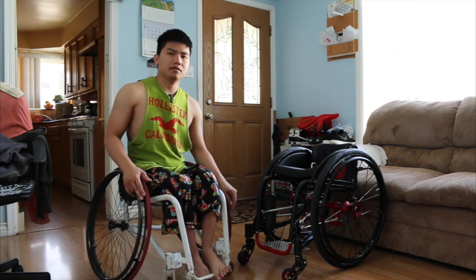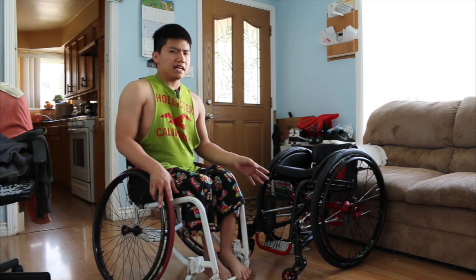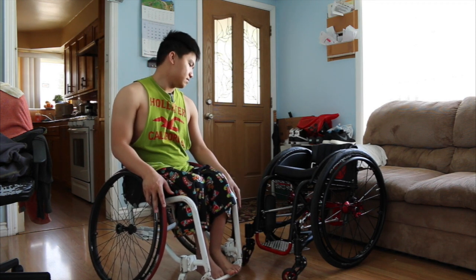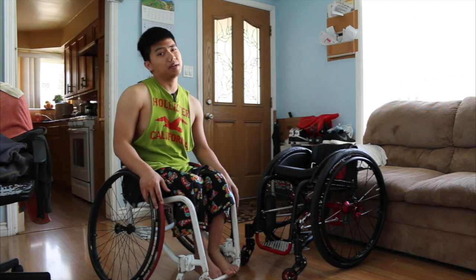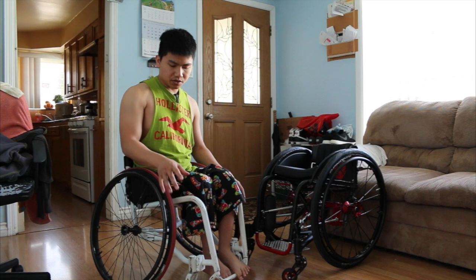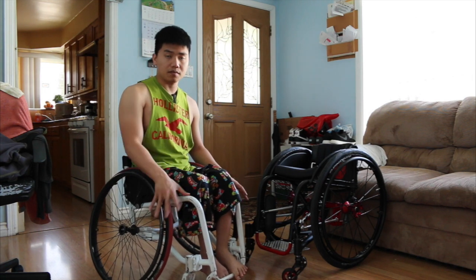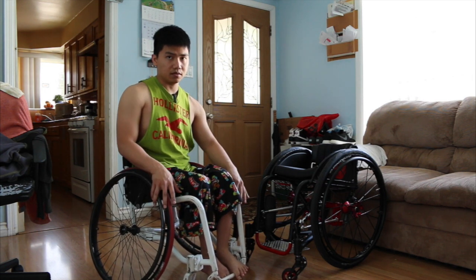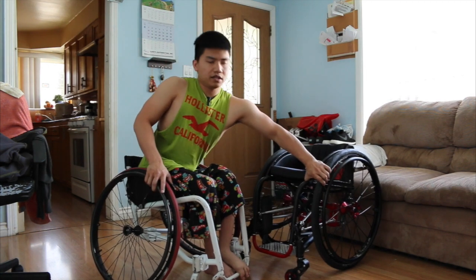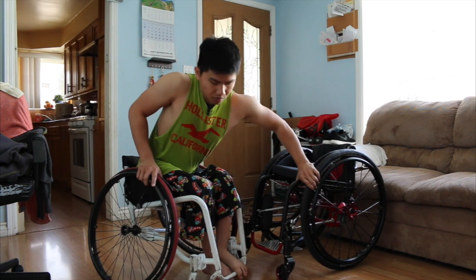I know that some people may need somebody to help them, but for me I don't need anybody to help me — I can do it by myself. I just need to be careful because both of my wheelchairs don't have brakes. Maybe I should get some. So to do the transfer, I have to grab both wheels — one from each wheelchair — so they stay in place and don't move.